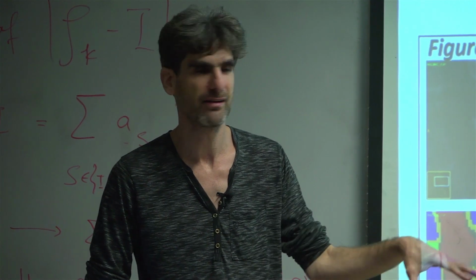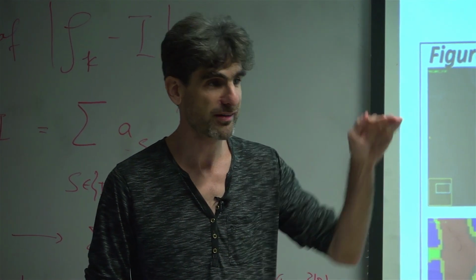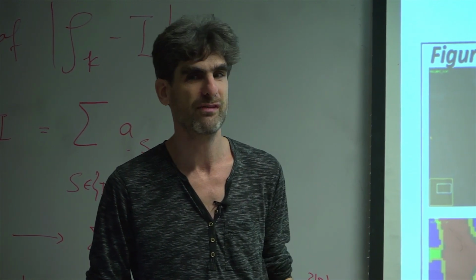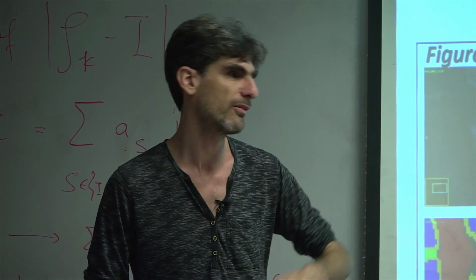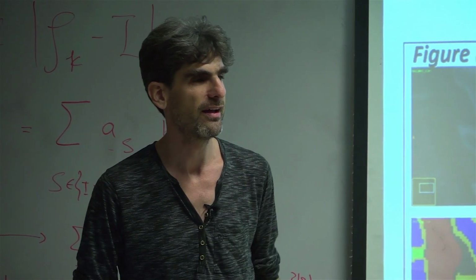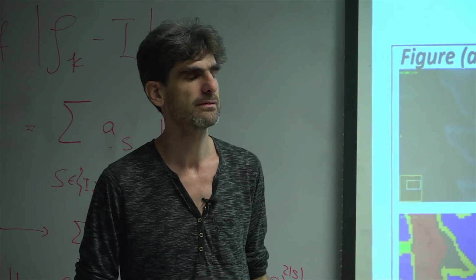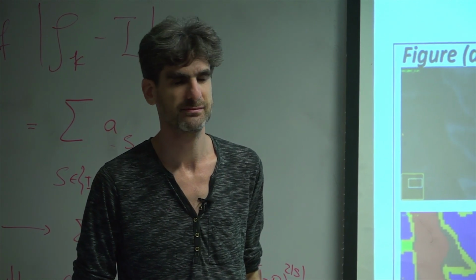It's very different to get a classical algorithm approved, where if something fails, at least you understand which stage of the algorithm failed. It didn't find the spinal canal. It didn't find this. It's very different to get approval for a neural network, where you just get all these numbers, and it's much harder to analyze. Yeah, it is the same question as in automatic cars. It is machine learning based, and it's very similar. Who is to be blamed?